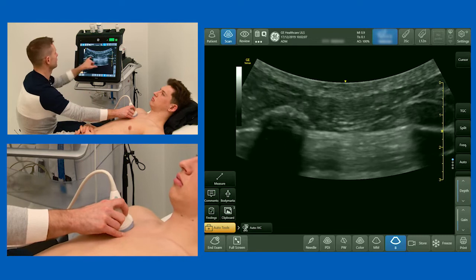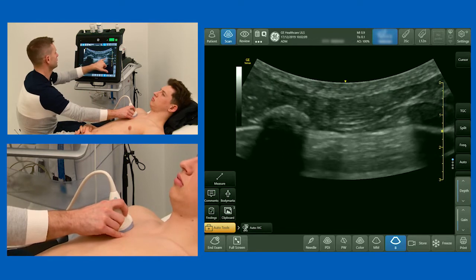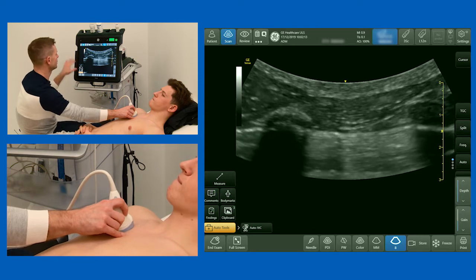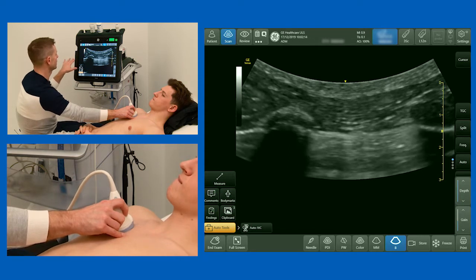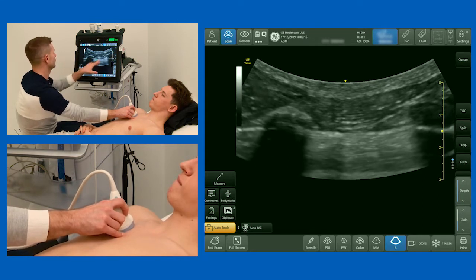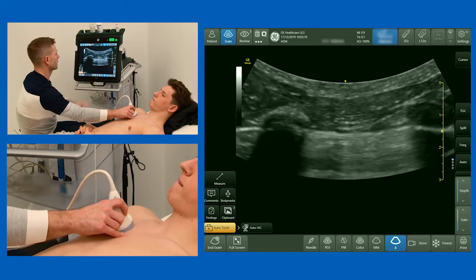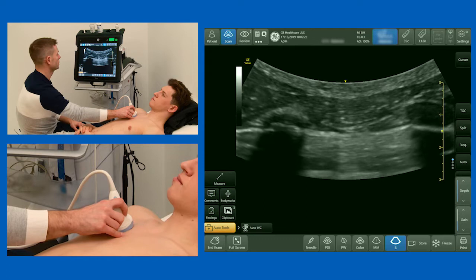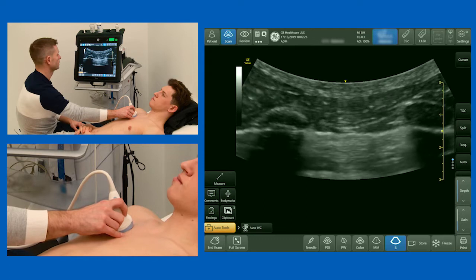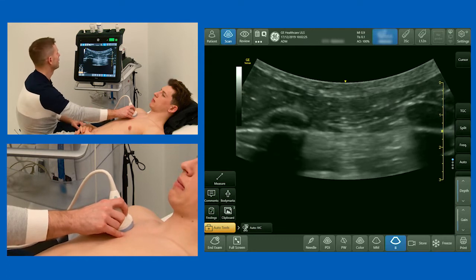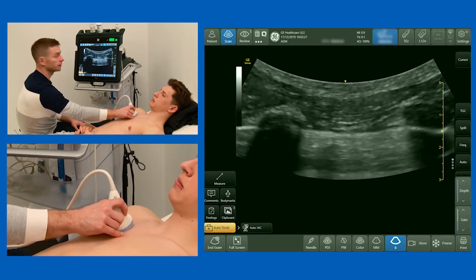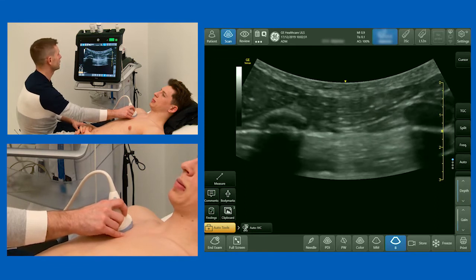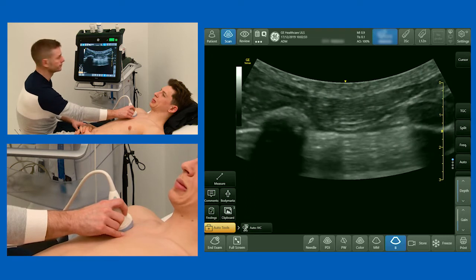Here we can see our ribs again and this bright white pleural line in between them. You can see this line moving backwards and forwards with respiration as those pleural layers slide over one another. This is normal. If those pleural layers aren't sliding over one another, it signifies that there is a disease process going on.